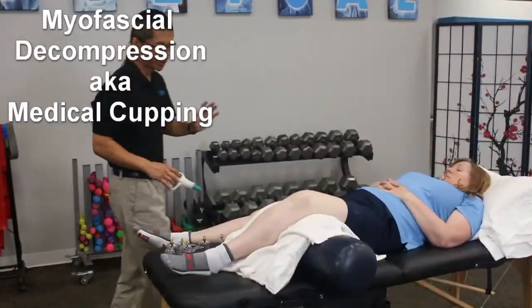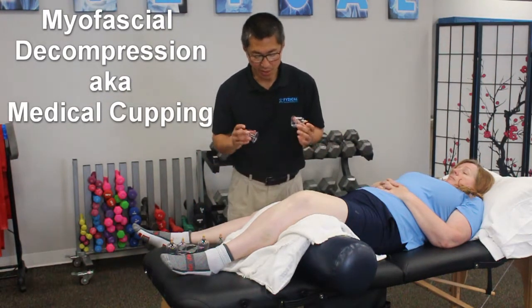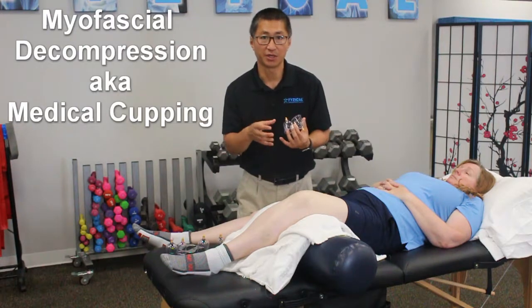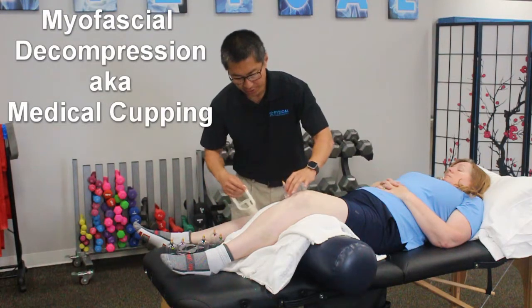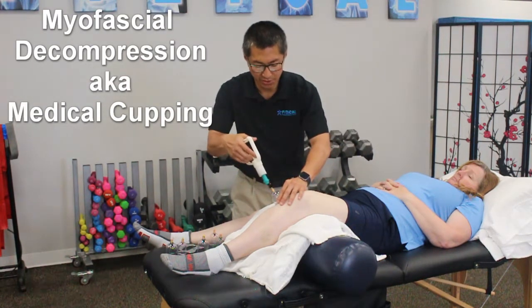Okay, so from there what we're going to do is use some of our cups, or what we call myofascial decompression. And what this does is it allows us to decompress the areas that are injured. Again, when things are injured, they're going to form scar tissue, and what we don't want is that scar tissue to form in a bad way. So sometimes this can help that scar tissue unload and also encourage the circulation to flow into the area. So we already have some cream there, and I'm just going to pop this around the MCL, nice and gently, because this is an acute injury.